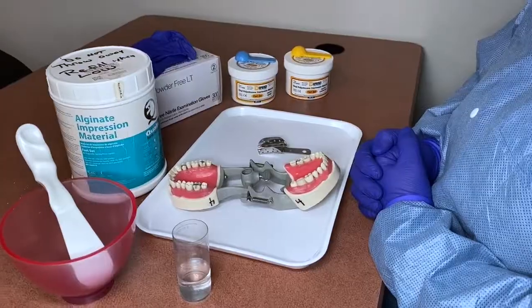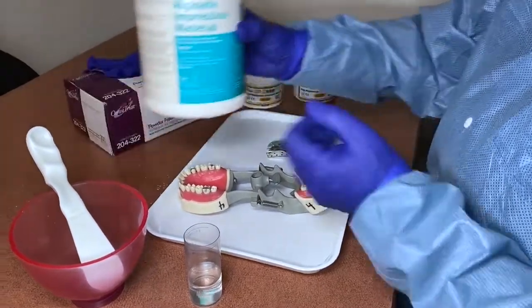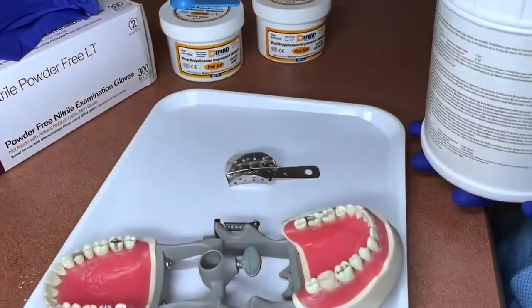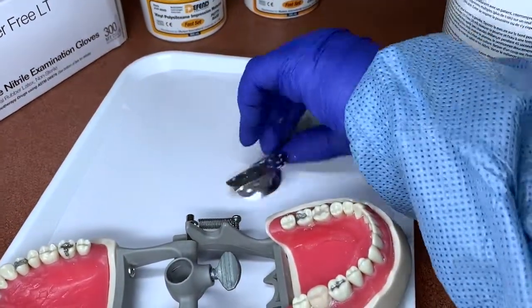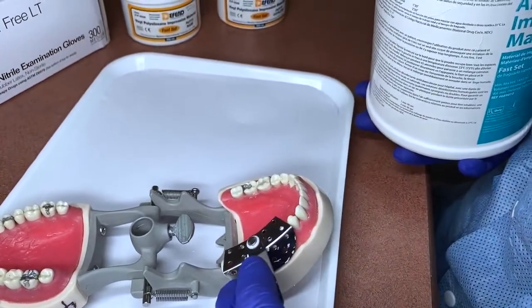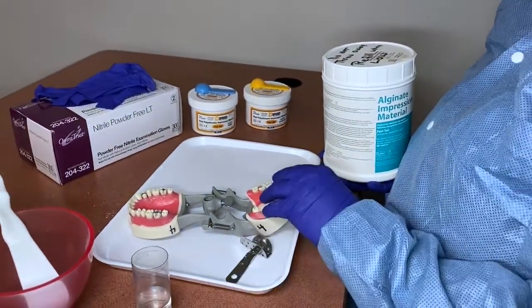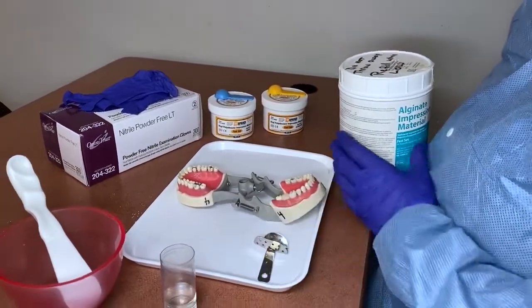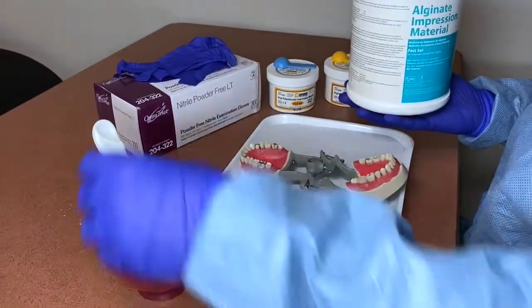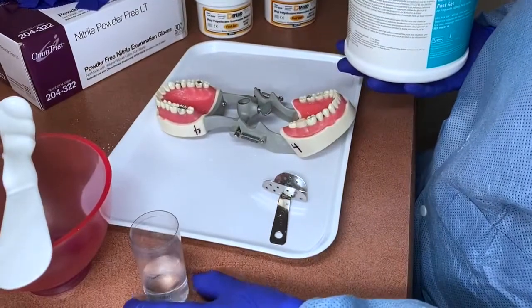First, we're going to take an impression with alginate. You don't need a full-mouth impression — as you can see, we're using a quadrant tray that covers just two to three teeth, so you're not wasting extra alginate or VPS putty. Make sure you have everything out: your alginate, your mixing bowl, and your mixing spatula.